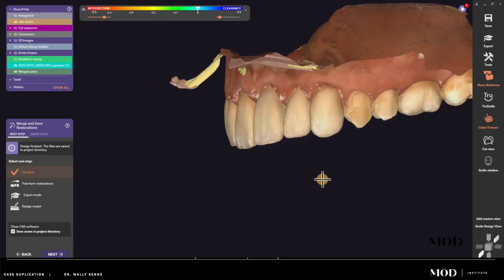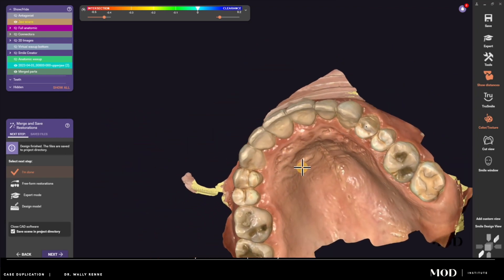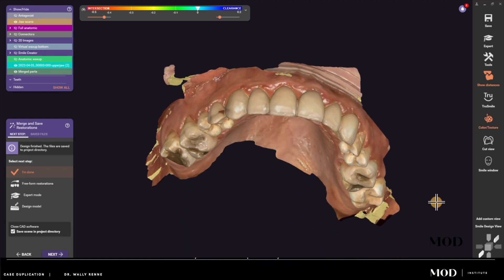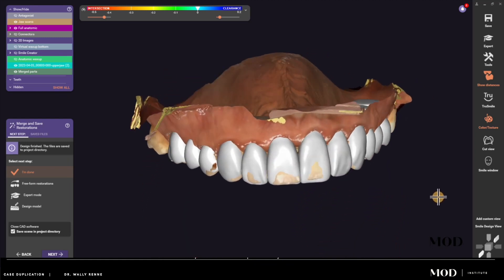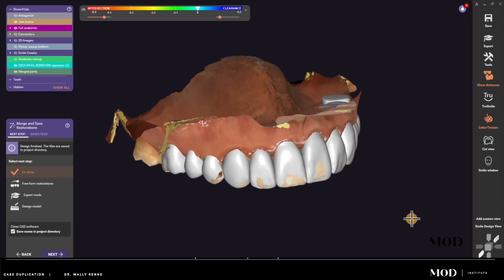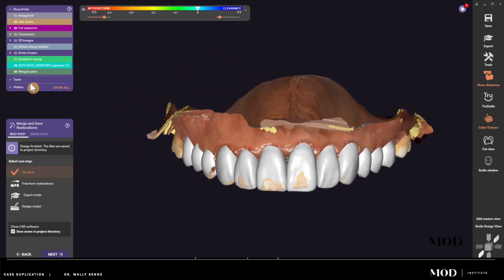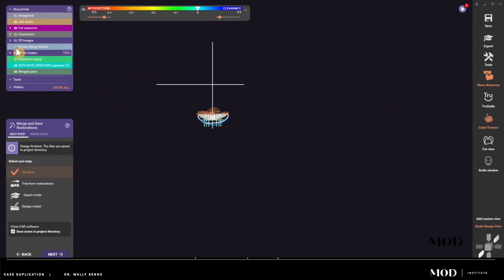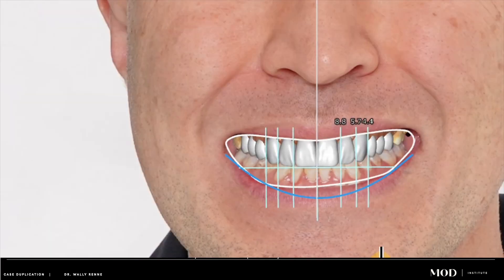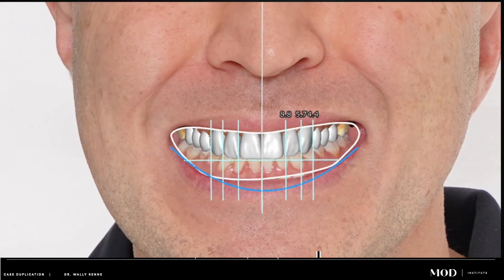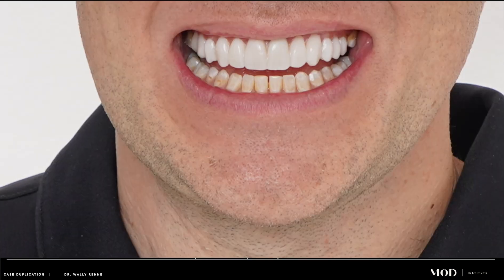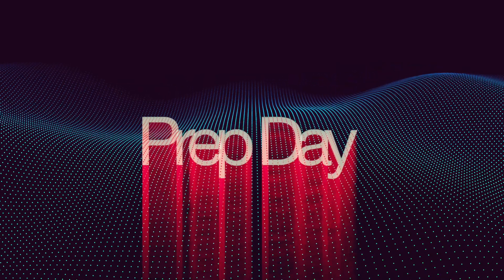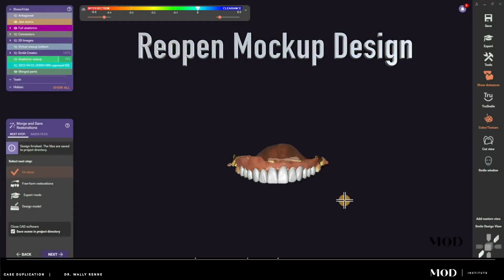We waxed and sculpted the smile with the patient in the chair, giving me feedback on how they'd like their smile to look. We then 3D printed the models and printed a mock-up to try in the patient's mouth to make sure it was something he would like before committing to treatment. One of my least favorite things to do is replace existing dental work because you never know what's underneath. Here is the mock-up just tried into the patient's mouth.